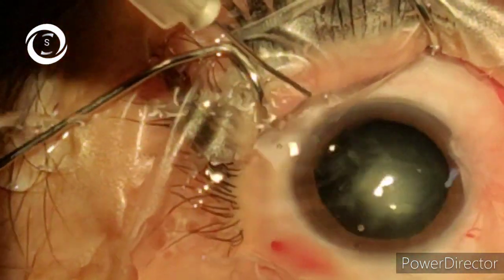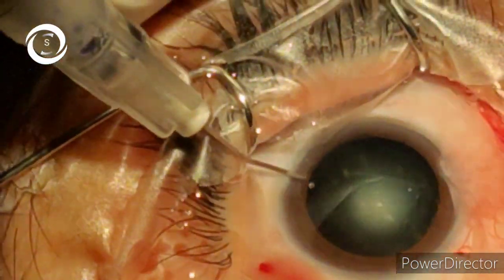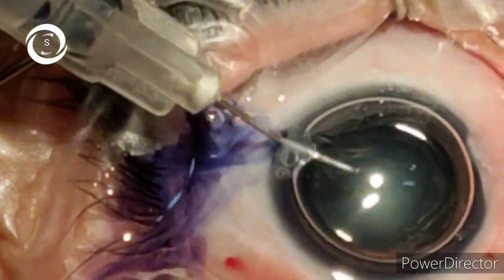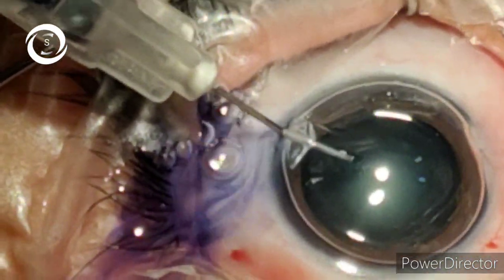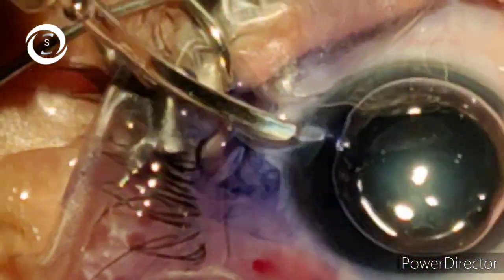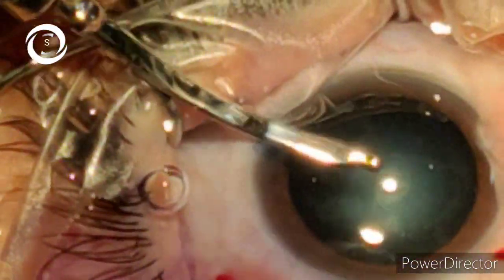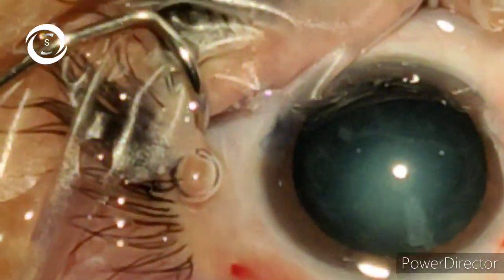Today in this phacoemulsification of nucleus sclerosis 2 and posterior subcapsular cataract, I will emphasize on the two most important rate-limiting steps of phacoemulsification which are vital for learning this art.